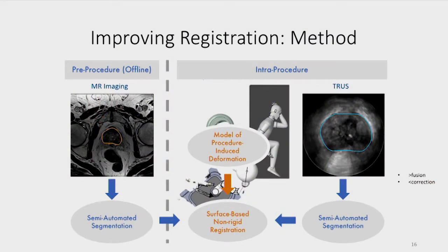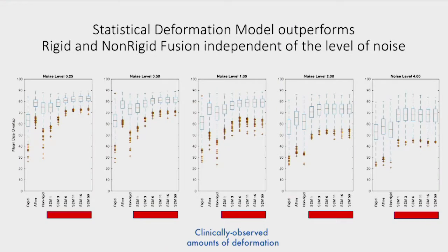And if I see it curved or deformed, I make an adjustment. I also do transperineal biopsies with fusion as well. I use the deflection to sometimes get around that little area where the puborectalis muscle pulls up the rectum, so you don't go through the rectum doing transperineal. So I don't mind the deflection as long as you watch it happen, and it depends on the amount of deformation, the type of unit you use.